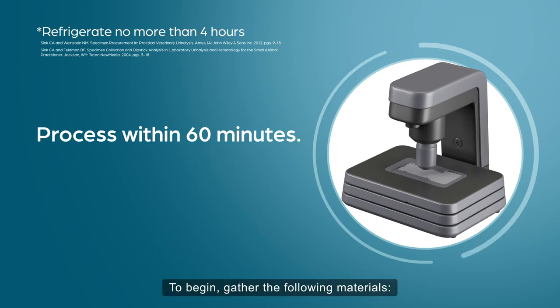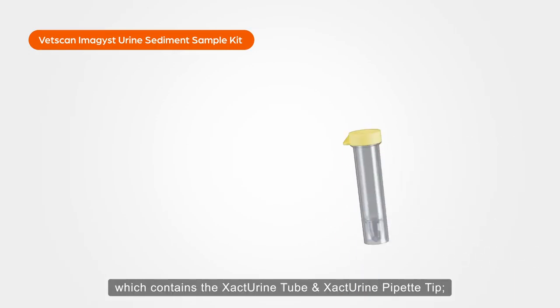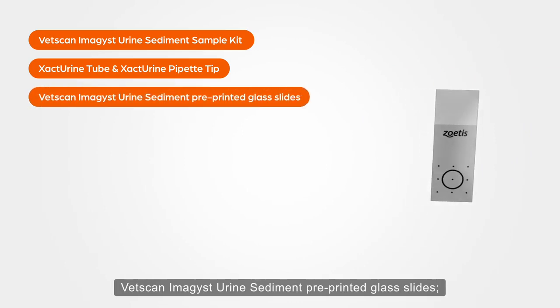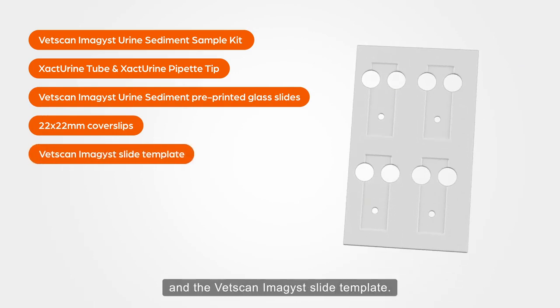To begin, gather the following materials: the VetScan Imagist urine sediment sample kit, which contains the exact urine tube and exact urine pipette tip, VetScan Imagist urine sediment pre-printed glass slides, 22 x 22 mm coverslips, and the VetScan Imagist slide template.